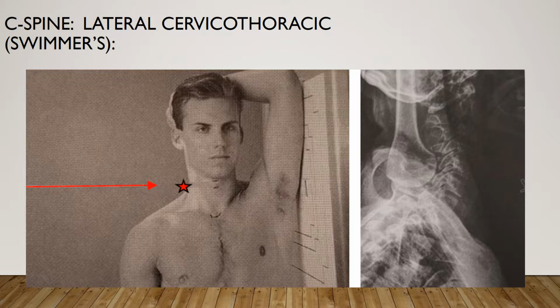Separation of the humeral heads from the cervical spine, vertebral bodies in lateral perspective, optimal density and contrast of the lower cervical and upper thoracic spine with no motion, and soft tissue and bony anatomy are visible.